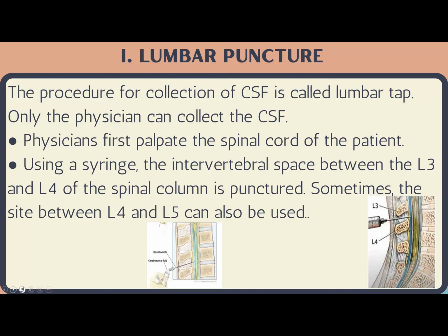Let's start with your lumbar puncture. Lumbar puncture, class, is the procedure for collection of CSF. It is known as your lumbar tap. This is the most common. Now, only doctors or physicians can collect the CSF. The physician, class, would first palpate the spinal cord of the patient. Now, using a syringe, the intervertebral space between the L3 and L4 of the spinal column is punctured. So the physician would look for the L3 and L4 vertebrae. And between the L3 and the L4, class, he will puncture. The physician will make a puncture in the space between the L3 and the L4.